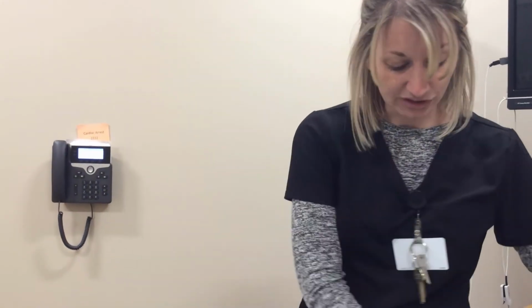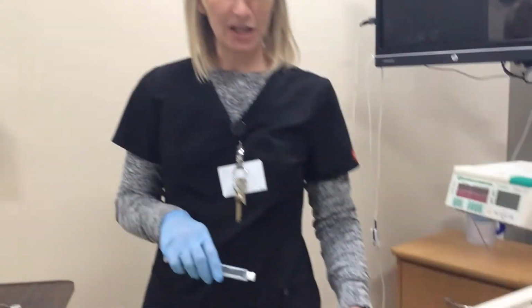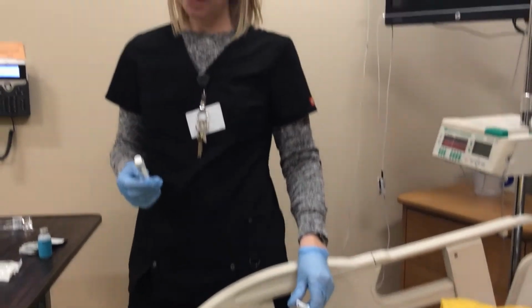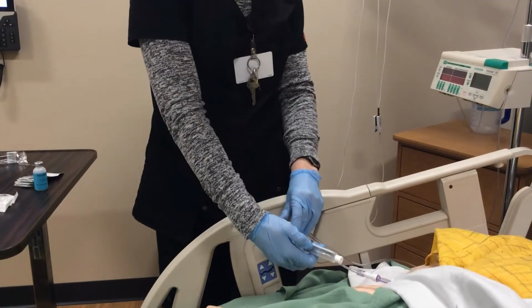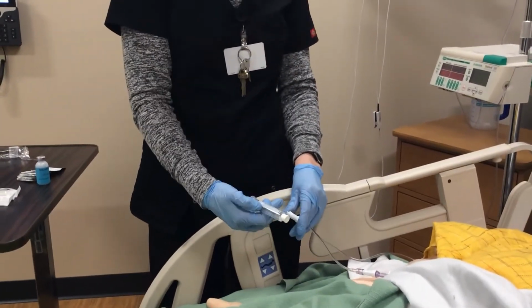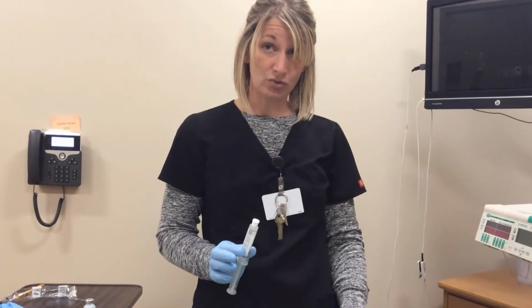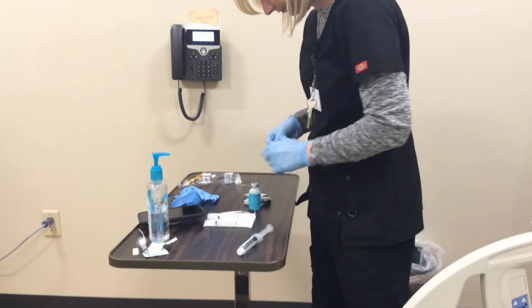And when I say buffer, what it's basically meaning is that I put my pump on hold. I'm going to pinch here just like I did before, but instead of pushing medication in and then releasing, pushing medication and releasing, I'm going to keep it pinched the whole time because I'm giving a saline buffer beforehand, a buffer between whatever solution is in this line and my medication, as well as after I give my medication, I'm going to give a buffer too, okay? So I have my saline to use as my buffer.